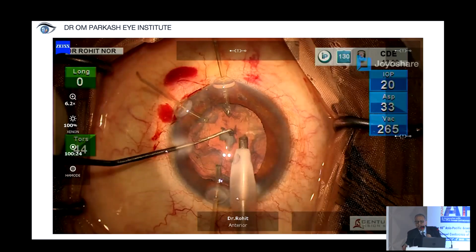Dr. Chee, any comments about that? Would you like to add? I think just once you have hooks in place, to me, as long as you fully fill up the bag and distend the bag, it doesn't matter which way you go. Yeah, but if that has not been done, then you go from intact to non-intact.